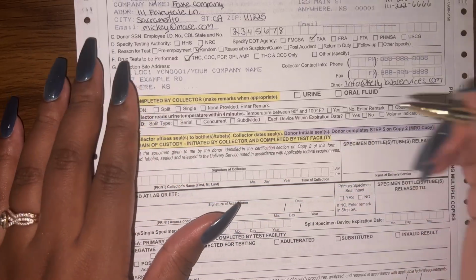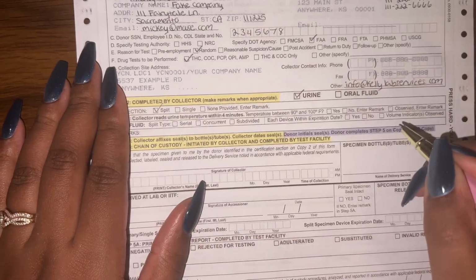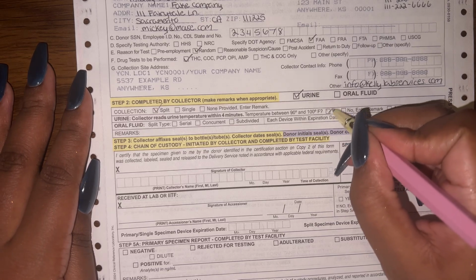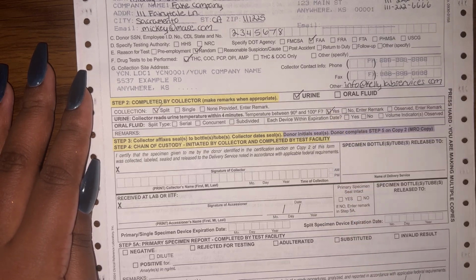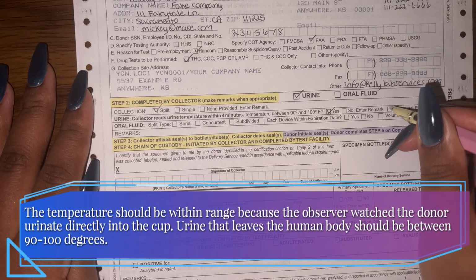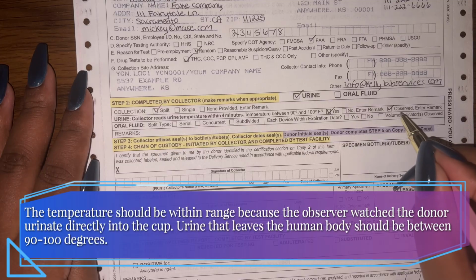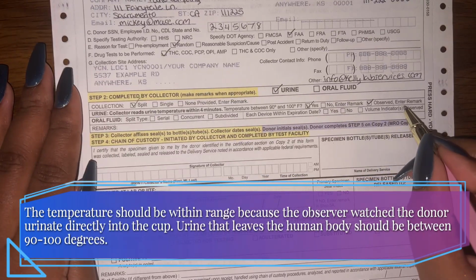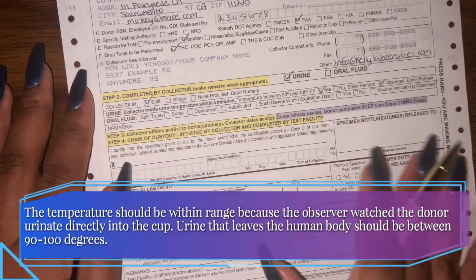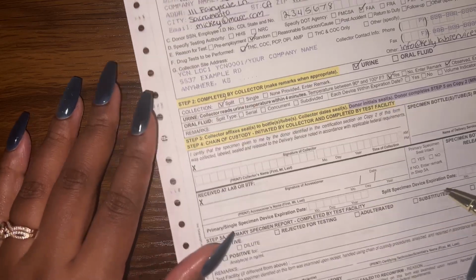So we're going to have urine. It's going to be split because we're going to split this one too and ship it to the lab. We're going to put yes now for the temperature because the temperature should now be within range. And we're going to check the box observed to indicate that we observed this screen. It prompts you to enter the remark, so you can't forget to put in your remarks down here.